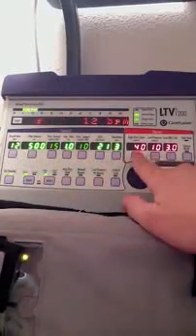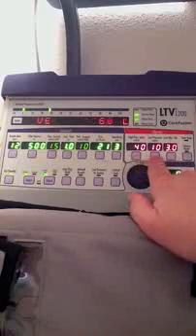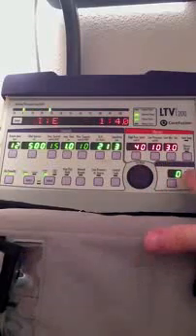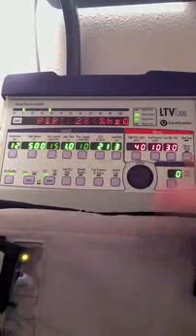And you can also see that I have some default alarm settings. My pressure limit is 40, low pressure 10, low minute ventilation 3 liters, and my PEEP is 0. And there, of course, is a silence/reset button.